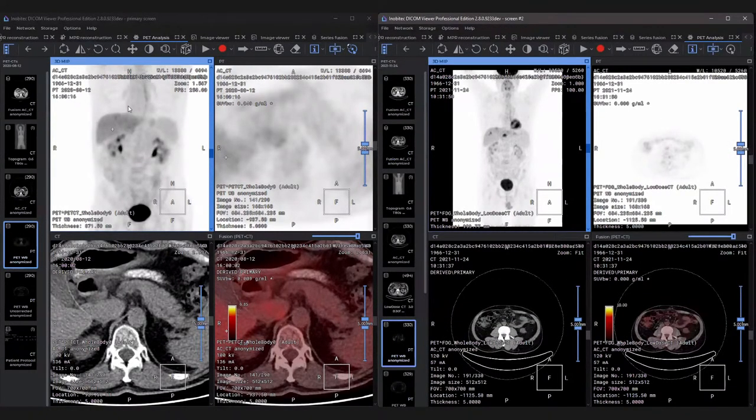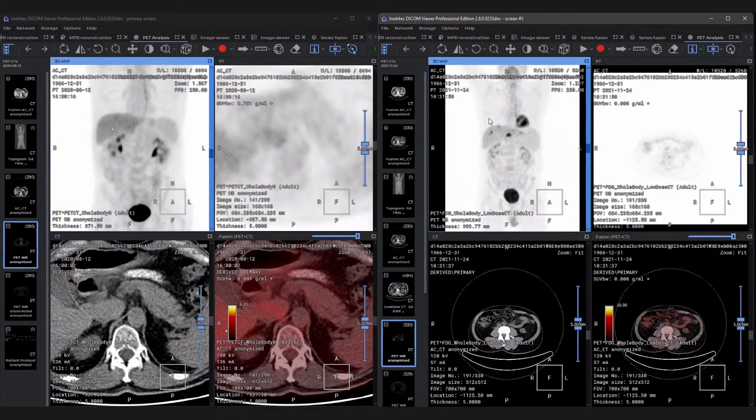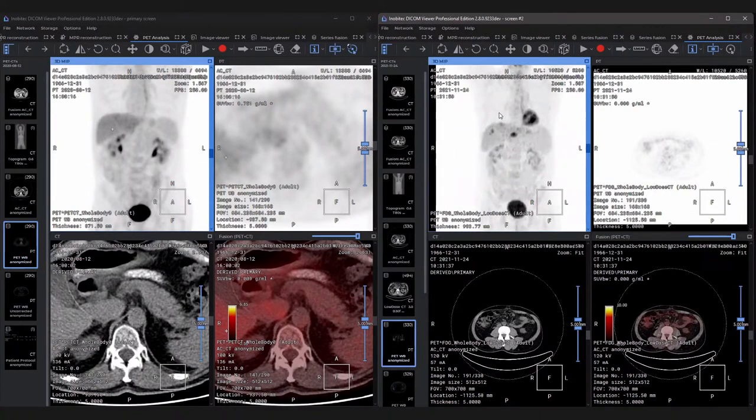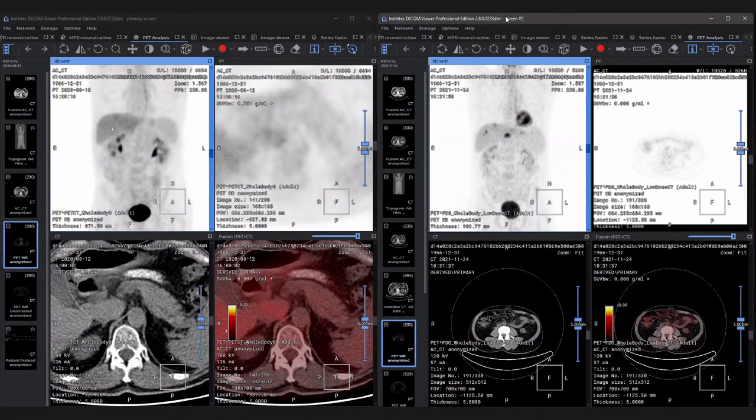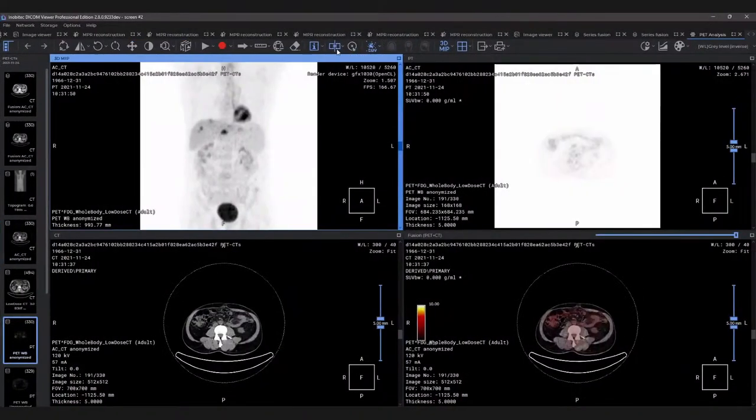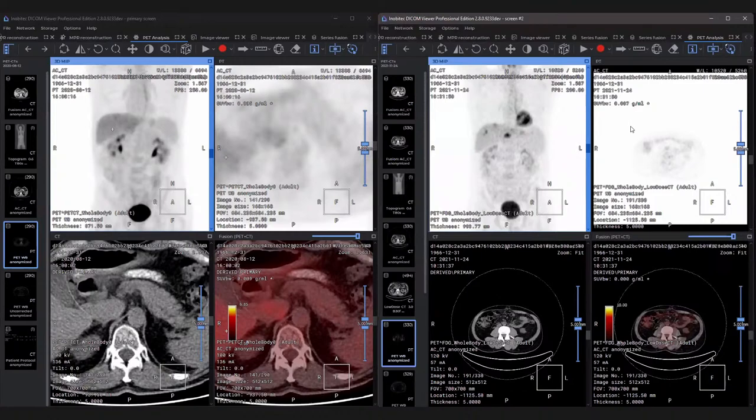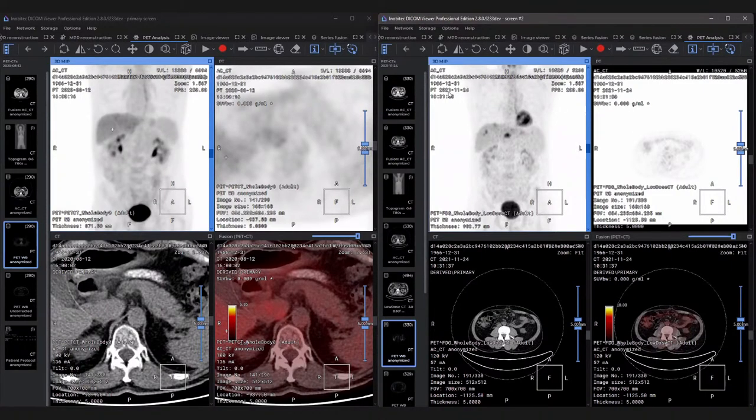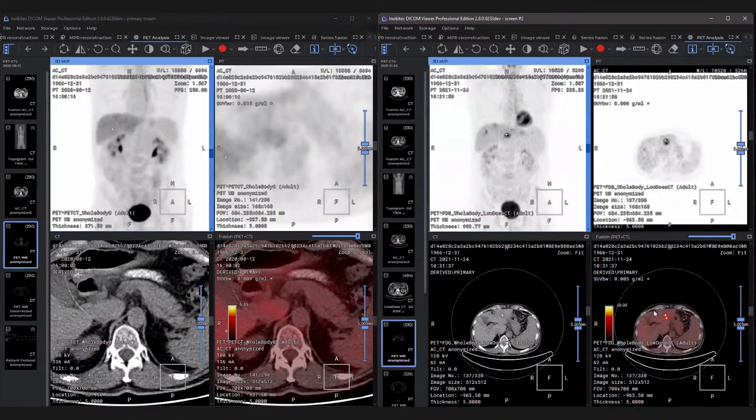What I might find to be very useful is the point pointer tool which allows us to quickly identify the spots of increased FDG uptake. Another very welcome feature is that the SUV values are shown automatically while we scroll the mouse through the study. Actually the additional modules and the advanced features is where the viewer starts to do the magic. It allows to perform the advanced analysis just with a couple of clicks of your mouse.